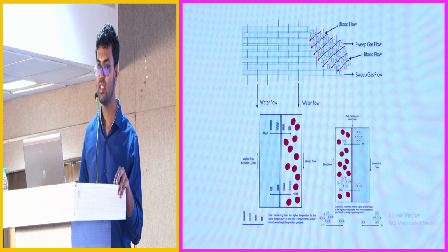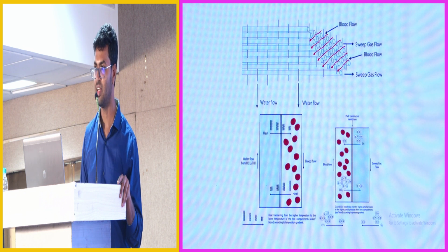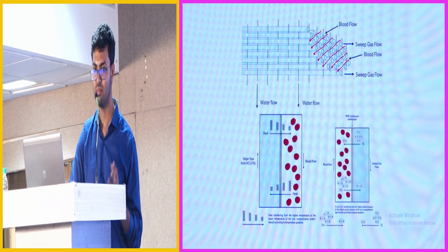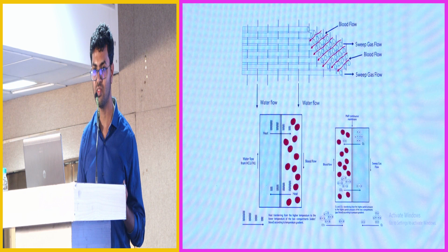So you have already seen the hypothermia associated with the CRRT circuit, where you usually rewarm the returning blood up to 41 degrees centigrade, which madam has shown already. But my advice is never rewarm the blood to 41 degrees centigrade. It will lyse the RBC. Making it up to 39 is okay. Beyond that, if you heat the blood, the lysis of the RBC will be more.